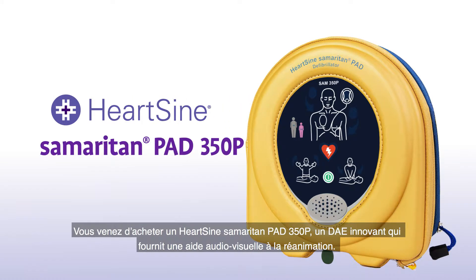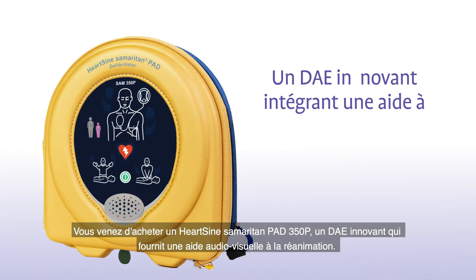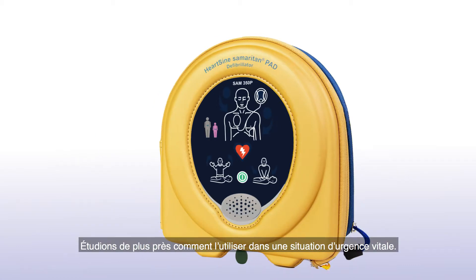You have purchased a HeartSine Samaritan PAD 350P, an innovative AED that provides audiovisual CPR coaching. Let's look at how to use one in a life-saving situation.